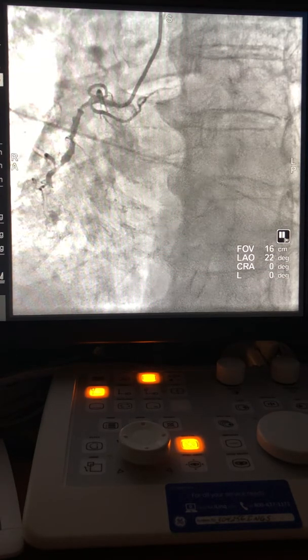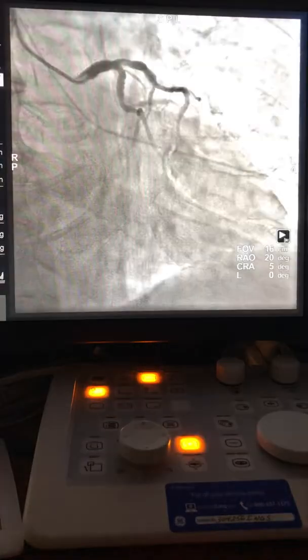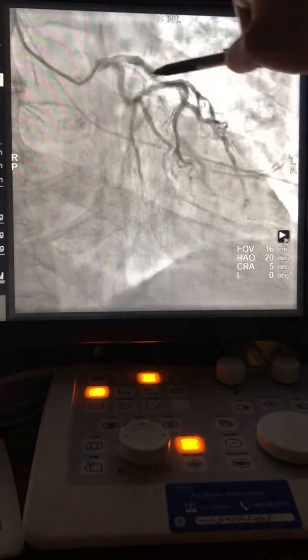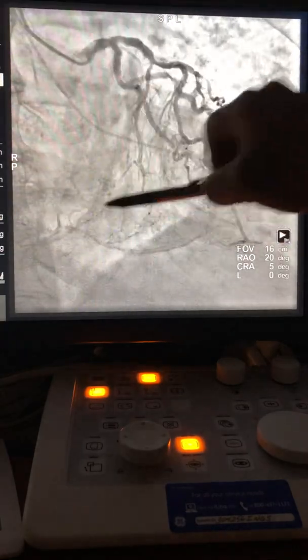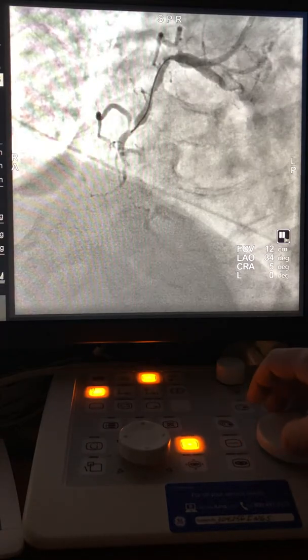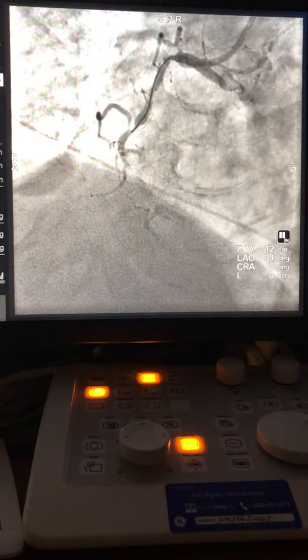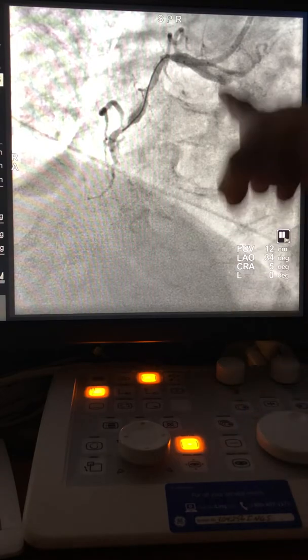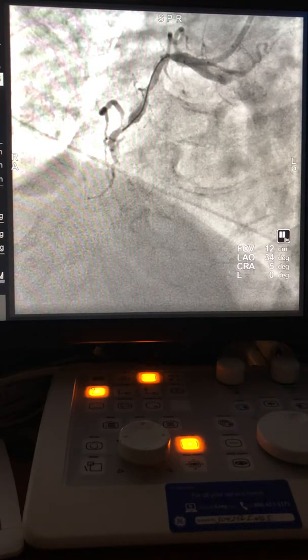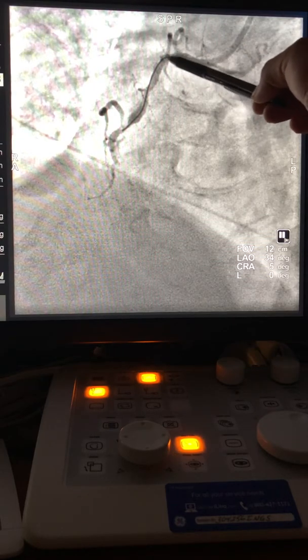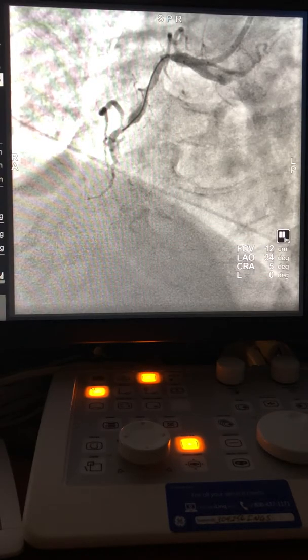There is a relatively good area here for the guide. You see there is diffuse blockage all over, and we're going to see how we support the wire to pass through. Here's the left angiogram — this is the LAD here and the circ as well, and you see the collaterals feeding the RCA. The first trick: make your own strategy for each case. The supportive guide in this case was XB RCA.